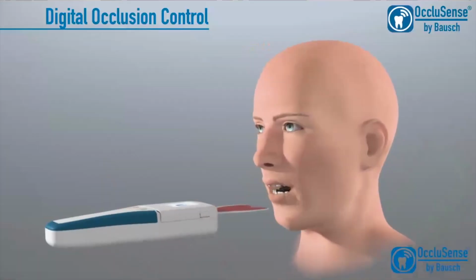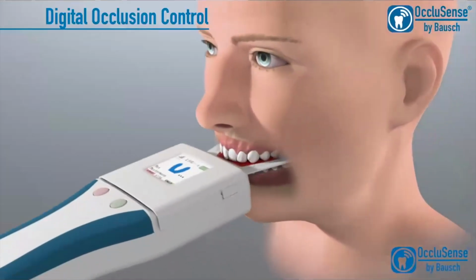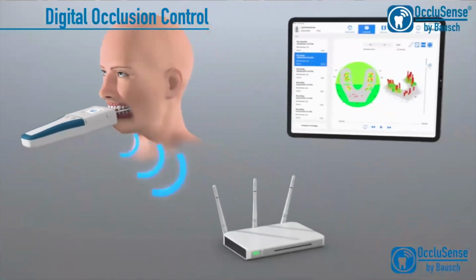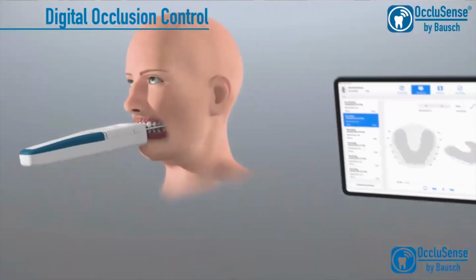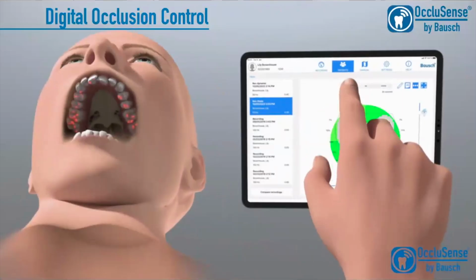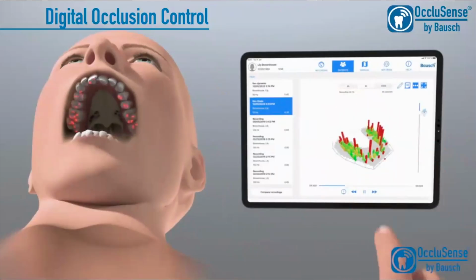Once this is done, you can insert the sensor into your patient's mouth and ask them to conduct any movement that you wish for. The data will then be wirelessly transferred to an iPad, where you then receive an output with your data. What you also see here, the marks of the OccluSense sensor, so of the occlusion that you have recorded, are also left on your patient's teeth. So this is not a process that you would need to repeat.